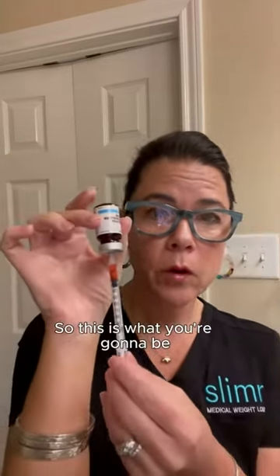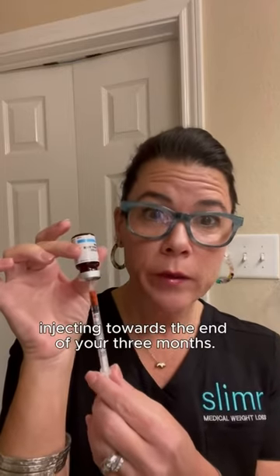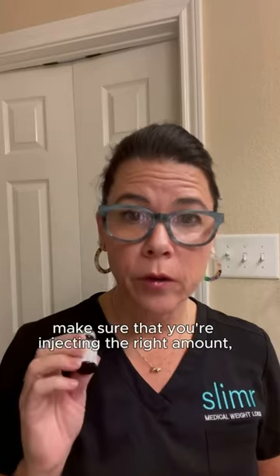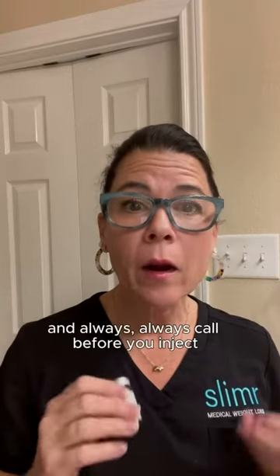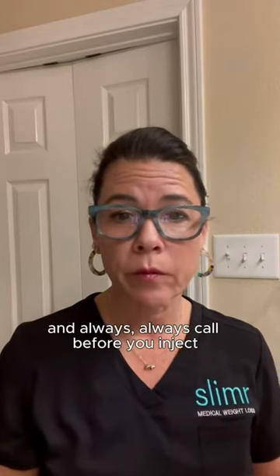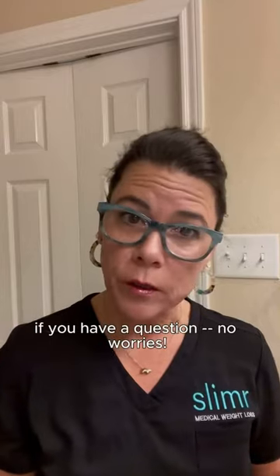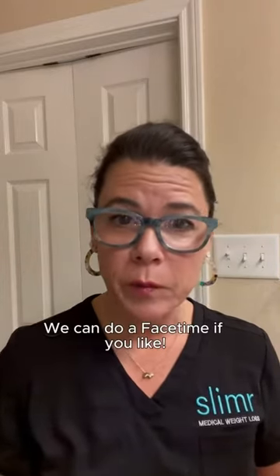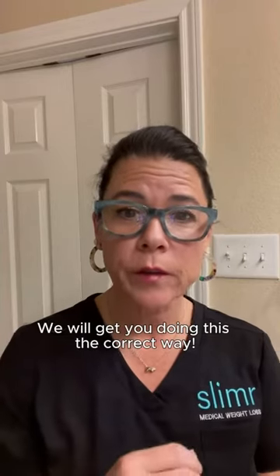This is what you're going to be injecting toward the end of your three months. Make sure that you read your script and that you're injecting the right amount. Always call before you inject if you have a question — no worries. We will help you out, guide you through it. We can do a FaceTime if you like. We will get you doing this the correct way.